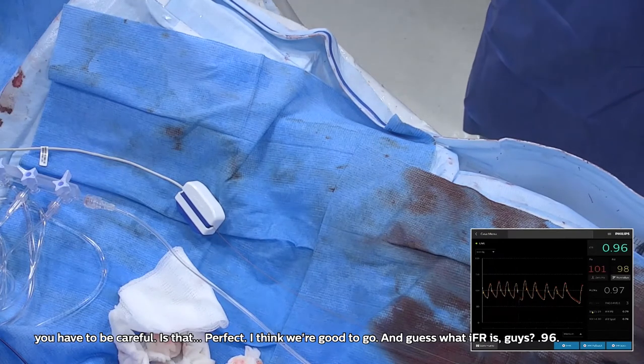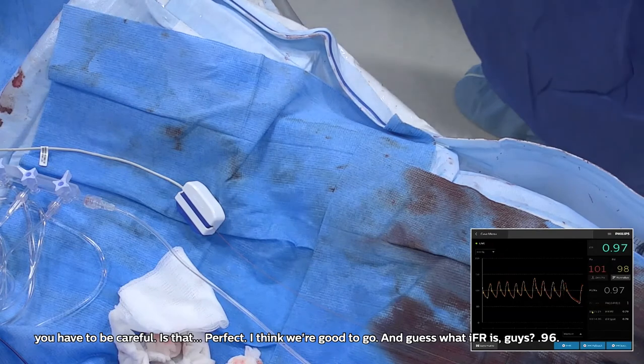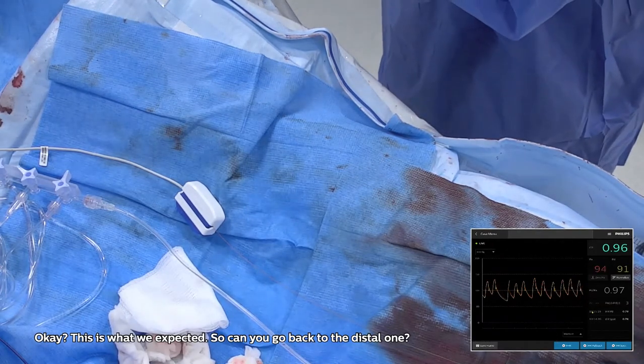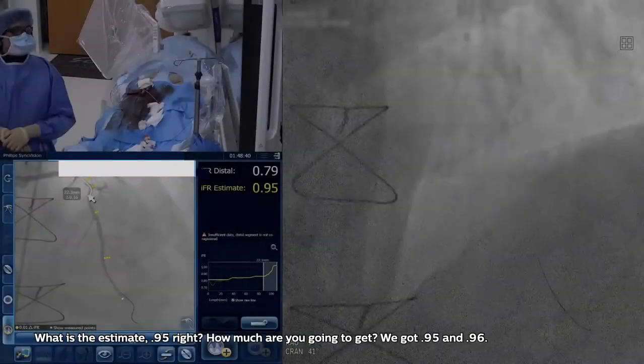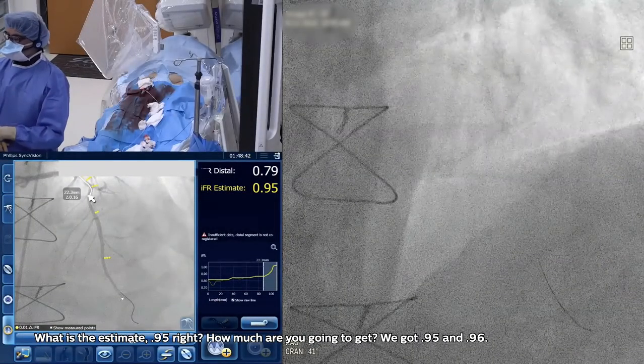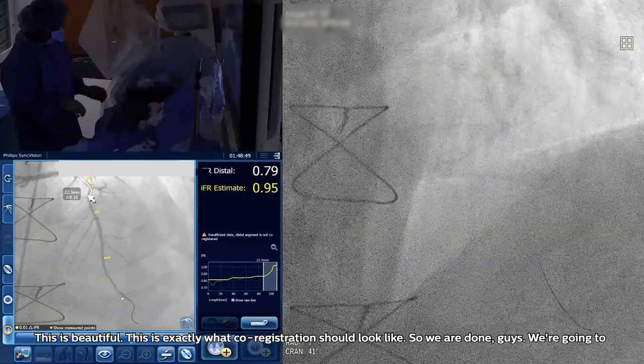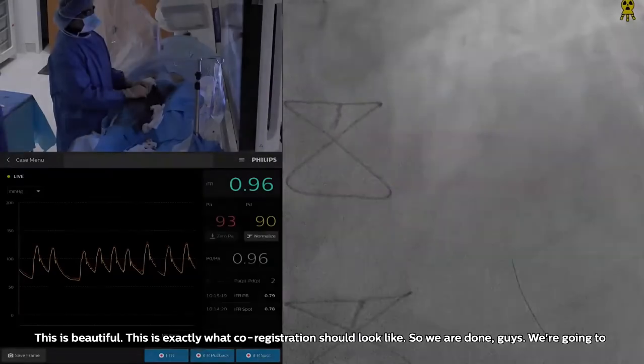And guess what the IFR is, guys? 0.96. Okay, this is what we expected. So can you go back to the distal one? What is your estimate? 0.95, right? How much are you going to get? We got 0.95 and 0.96. This is beautiful. This is exactly what co-registration should look like. So we are done, guys.